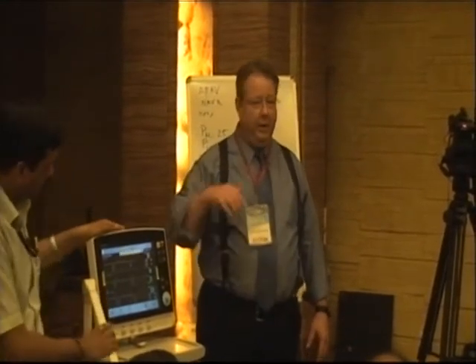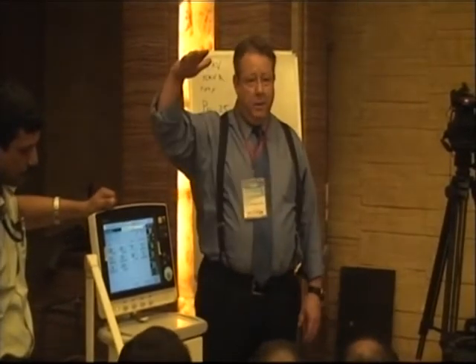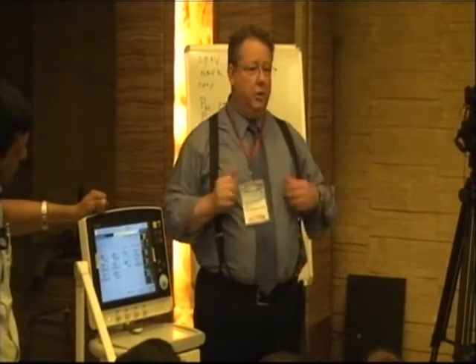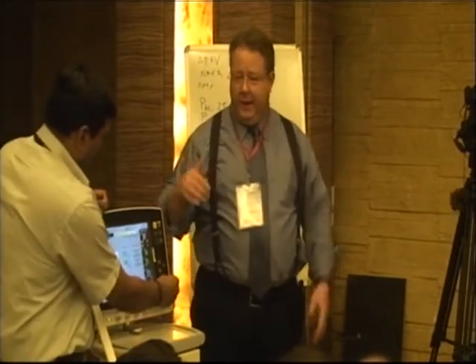And so what we do is we get a plateau pressure, say, of 25 or so. You set that peak pressure on APRV, the high pressure, at roughly 3 to 5 above that. So let's say 28 to 30 to set your high peak pressure. And so you will stay at that pressure for a long inspiratory time. So the worse the oxygenation they have, the longer you drag that out. So you're really thinking about releasing and letting them breathe only so often. And that's how this works.